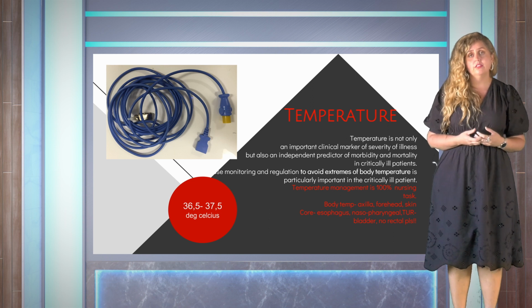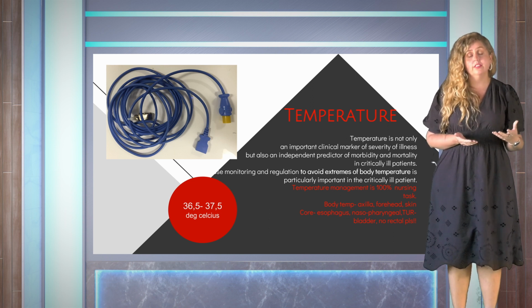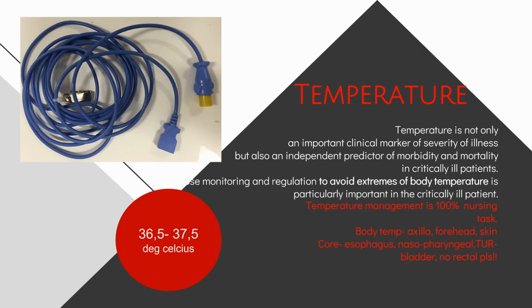This is very important. It really should be for all critically ill patients. And I've included a picture of that elusive blue cable that's always missing. This is the one that you need for this, and it needs to be looked after and available at all times.